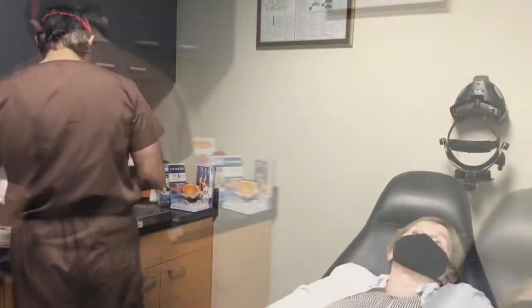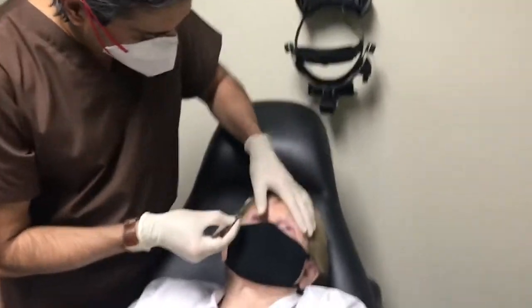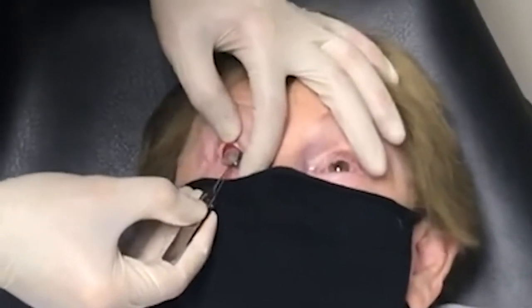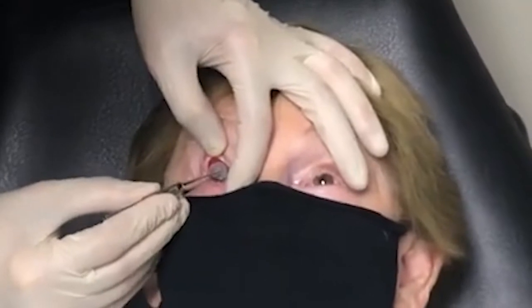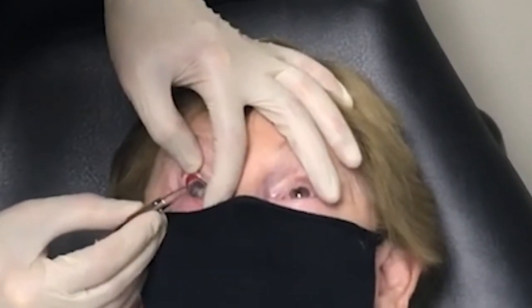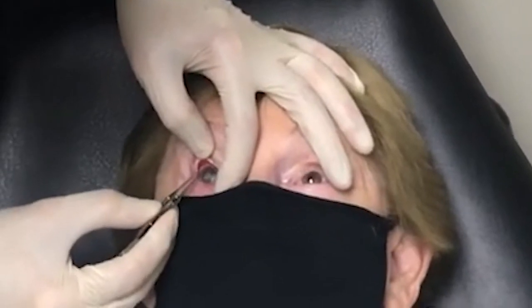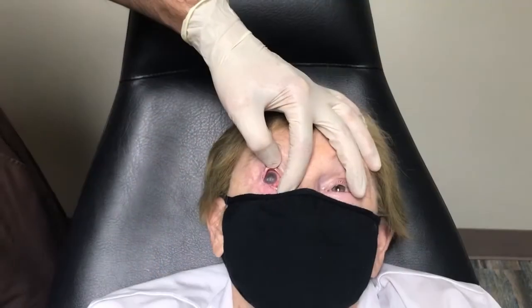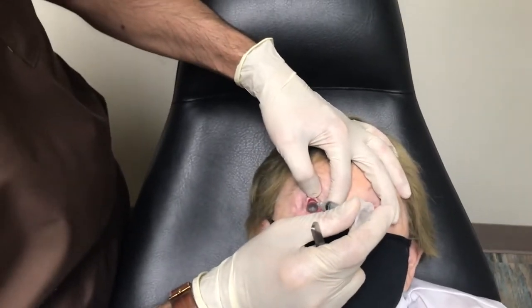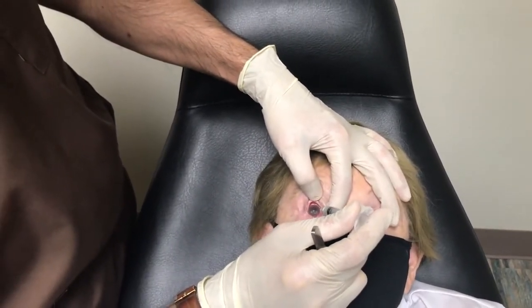Now I'm going to put the tissue in with the eyes wide open. She doesn't need anesthetic because it's a neurotrophic cornea. As you can see, I gently drape it on the cornea — just making sure it gets there so it hydrates itself on the cornea. I'll put another drop of the amniotic fluid from the cannula on it as well.